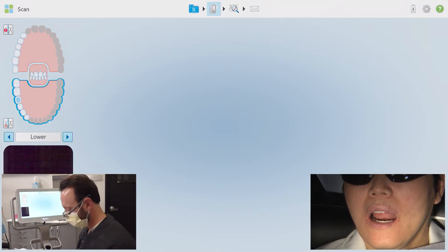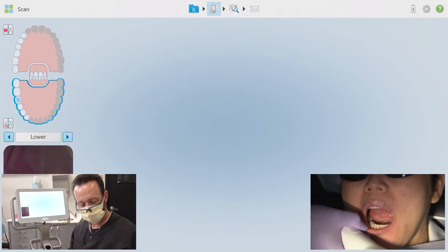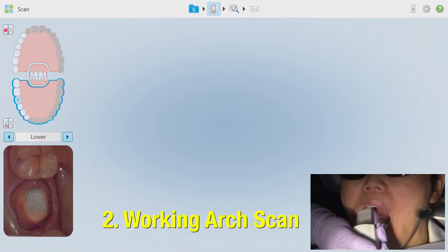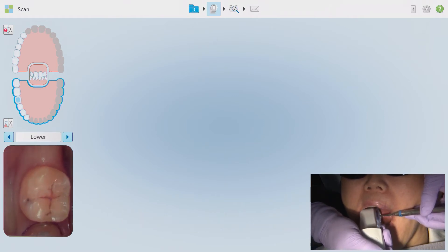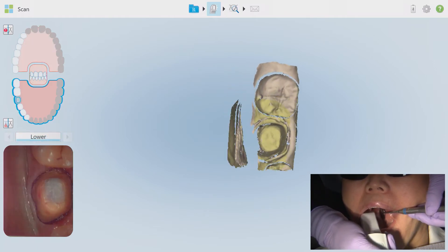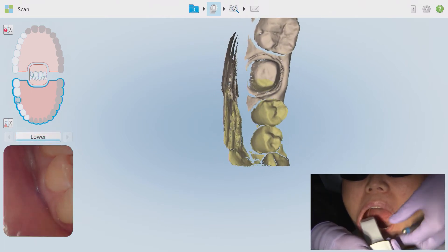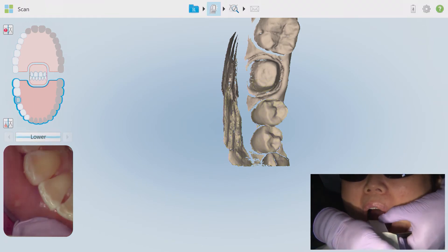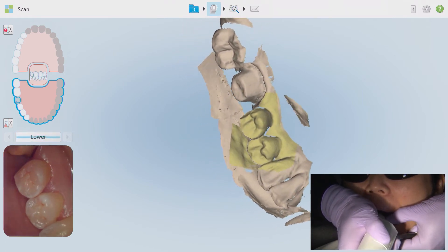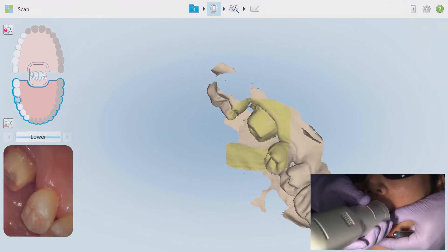I'll usually give the quad a quick suction or an air blast before setting the wand on the occlusal surface just distal to the most posterior tooth in the arch and start the scan. I'm scanning the occlusal surfaces first and moving towards the anterior. Once I arrive at the cuspid area with more incisal edge anatomy, I'll angle the wand a little more lingually inclined instead of facing straight down. Start to bring the wand back towards the posterior once you've reached the cuspid or lateral area, then scan the lingual making bold twisting motions back and forth throughout the arch.